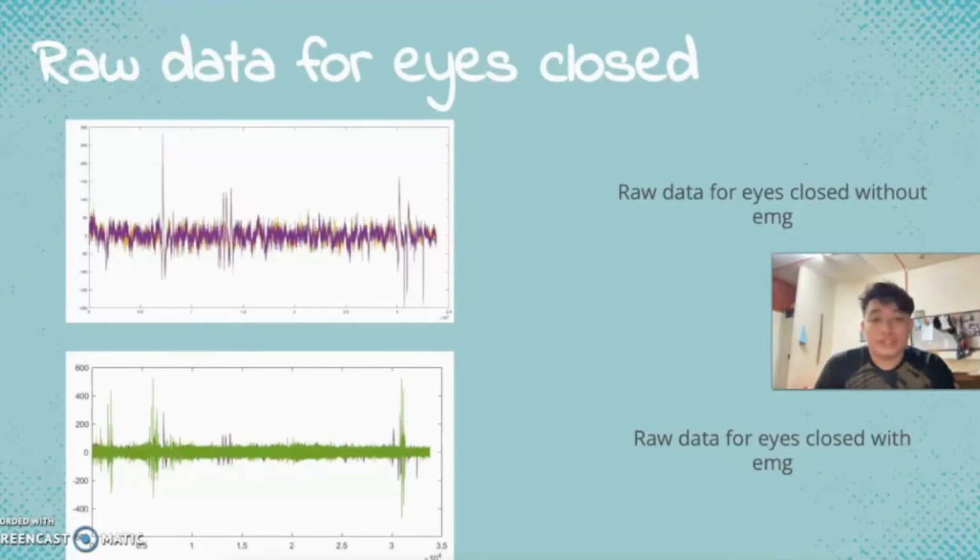For figure 1, the artifacts may come from the EEG machine itself, which we call instrument artifacts. Figure 2 shows more artifacts than figure 1 because it has additional artifacts from the muscles of the forehead, jaw, and eyelid, as this muscle movement can cause artifacts by moving the electrodes itself. Movements in the surroundings produce disturbance by altering the ambient electrical fields. Moreover, the tongue and the eyes have their own dipole electric charge. Therefore, their movement can get recorded by the electrodes.